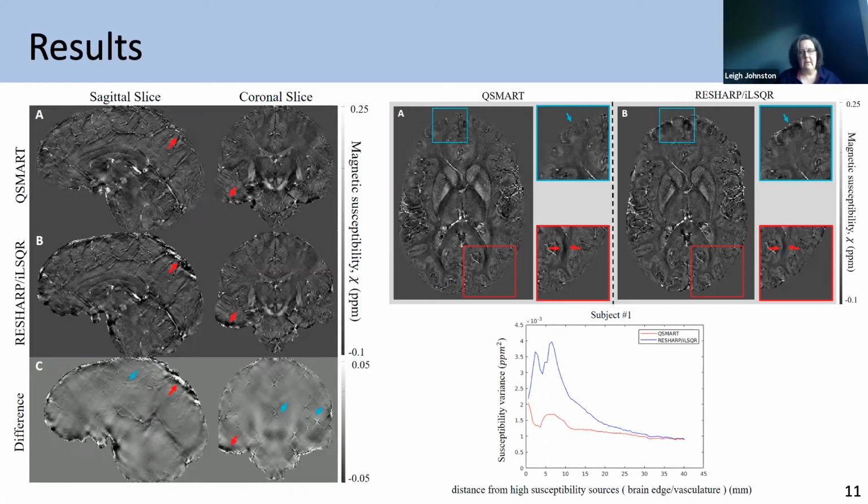I think when we claim that we're estimating magnetic susceptibility, we need to have a realistic picture of it, to say we won't immediately go and search for something that's at 3.5 ppm and say that that is a particular type of molecule. Okay, that's really not what we're trying to do with this.